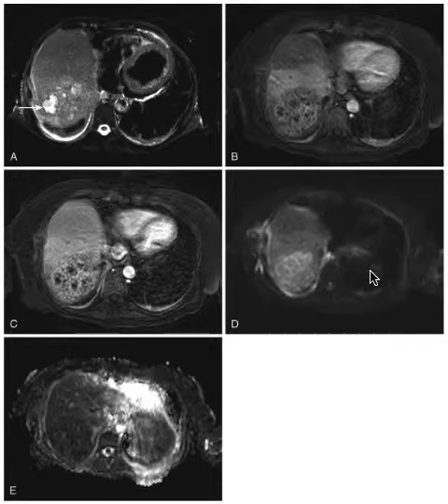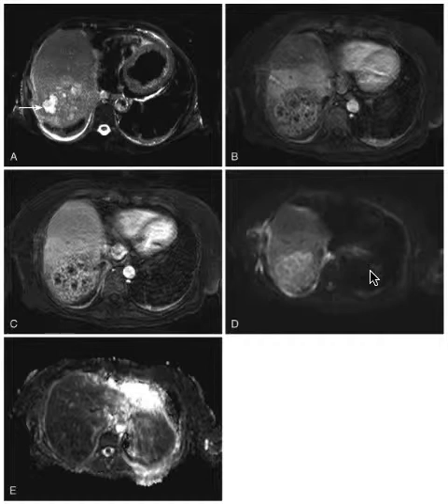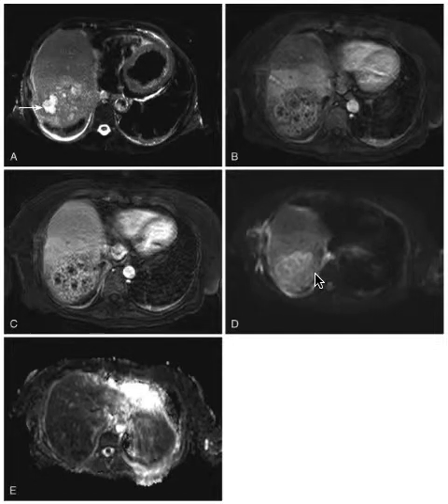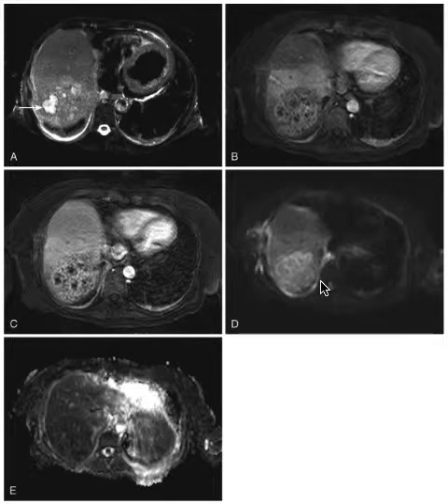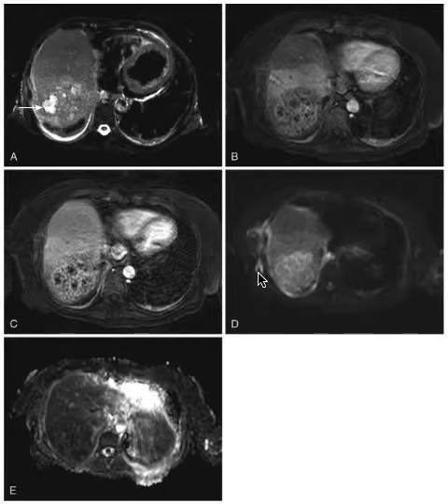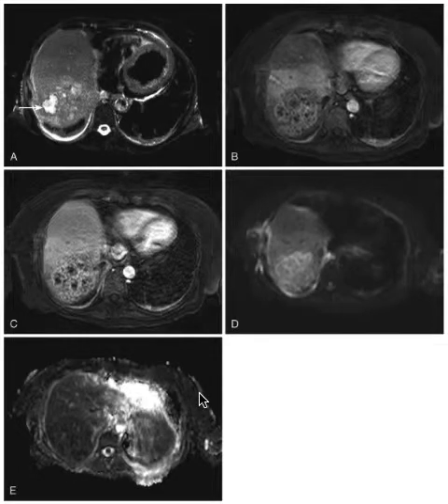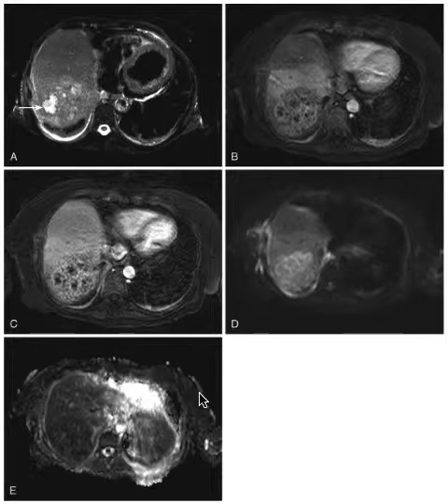We always want to verify our restricted diffusion with the ADC map. Whatever is bright on DWI should correspond with decreased signal on the ADC map. The reason is that brightness on DWI might be an artifact called T2 shine-through — a lesion that's very hyper intense on T2 may appear hyper intense on DWI as well, but if the ADC map also shows increased signal, we know it's not real restricted diffusion.